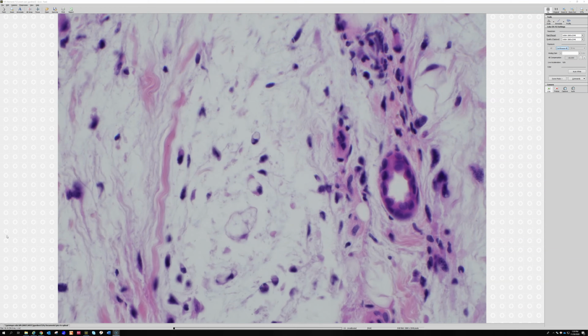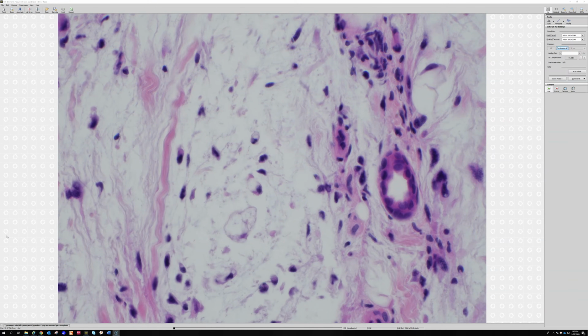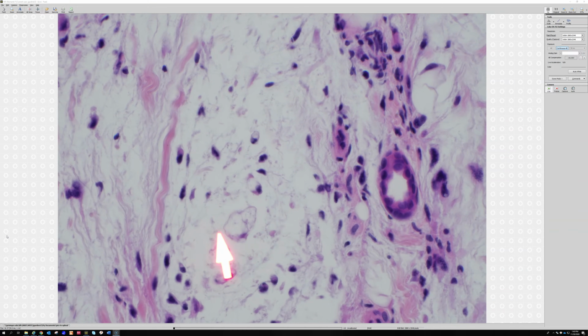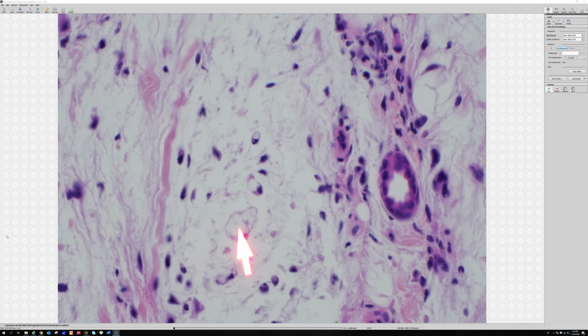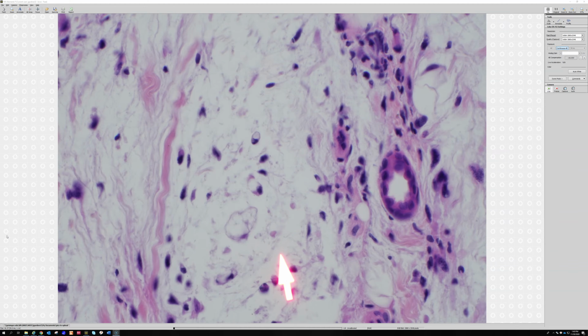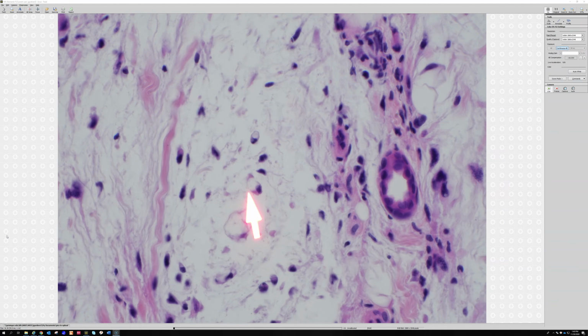They have vacuoles, but the vacuoles are not like the nice sharp circumscribed ones like we saw in the true pleomorphic lipoblasts. And also, even though it's a little hard to tell, it washes out a little on the video recording, it's got a little bit of bluish color in the middle rather than clear or white space. It's the same color as this background, and that's because this is a tumor cell that has sucked up that hyaluronic acid myxoid background. And here's another one over here.